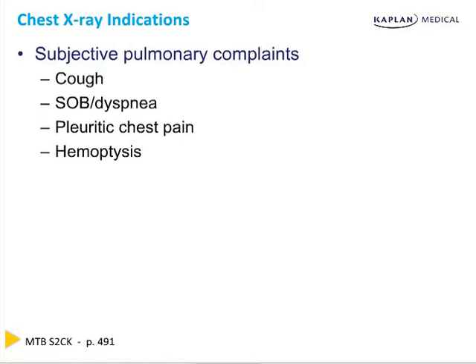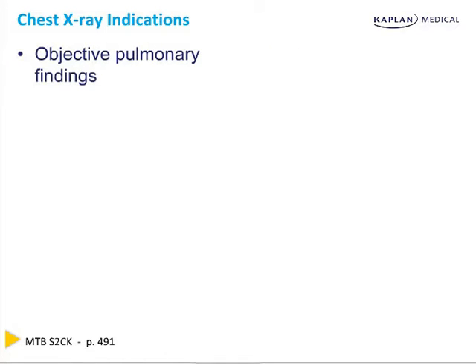Along with the subjective complaints just discussed, there are several exam findings you may see on the test which also warrant a chest X-ray if you are asked about the next step in management. Crackles, or rales, indicate fluid in the lungs, often secondary to pulmonary edema, and rhonchi are indicative of bronchial airway obstruction, sometimes secondary to COPD. These diagnoses can both be made from chest X-ray.